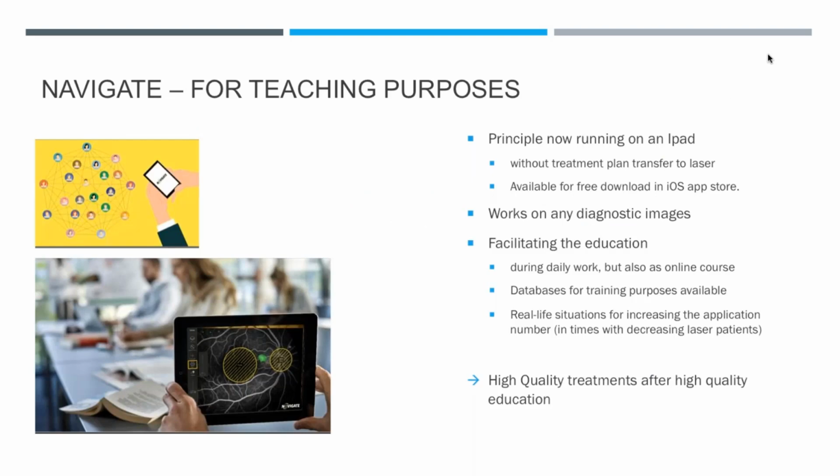The navigation platform is also used for education of physicians and medical students. We can now use an iPad with a retinal image in which the physician or trainee can create his or her own treatment plan, which is then consulted with a senior physician, and this can be used for future education. So navigation is a technology that opens up applications within the area of retinal diseases and ophthalmology as such.